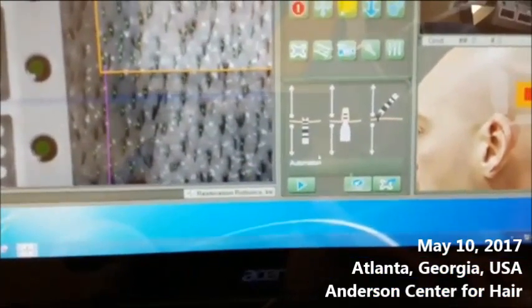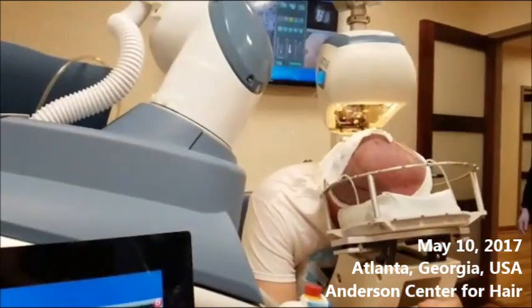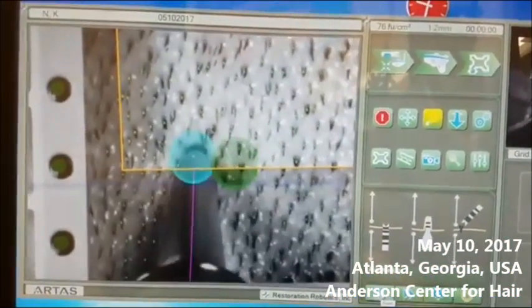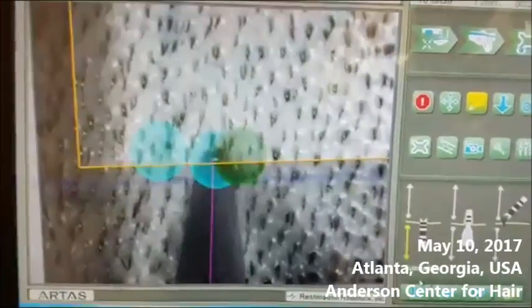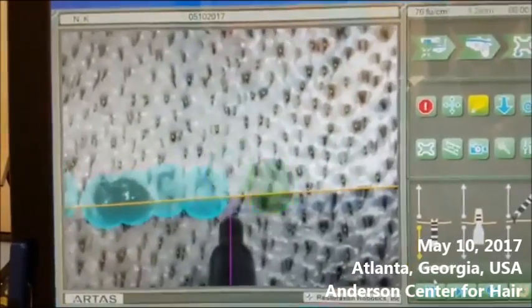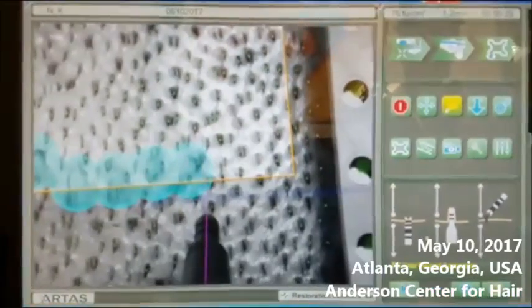So we come back over here. I'm going to take the prompts off — we've got a hair here. Charles, I'm going to do one here and make sure you don't feel it. Did that hurt? Nope, not at all. We're going to take the prompts off and do about 10 of these or so. He's got great angles, you can see there. That's 9 and 10 — we're going to stop there real brief.